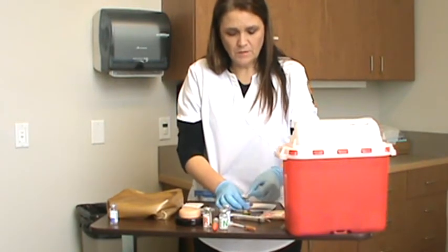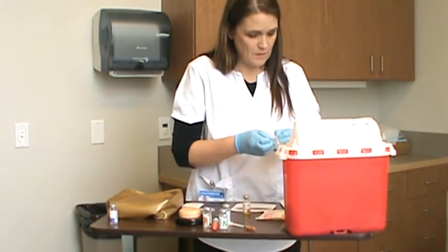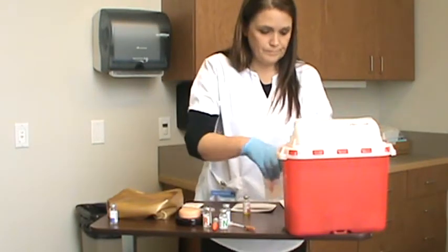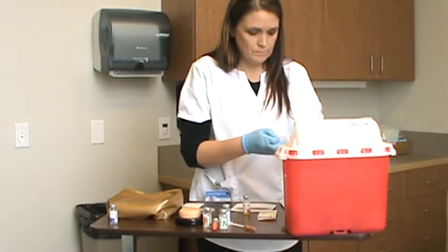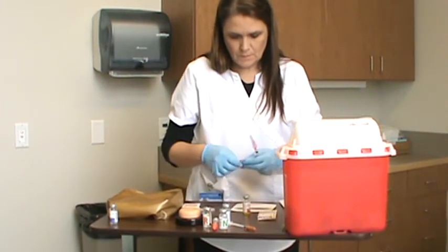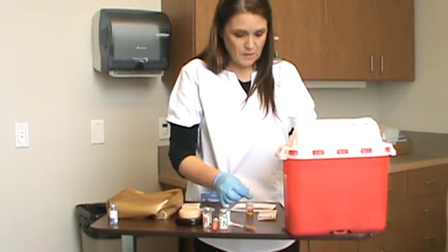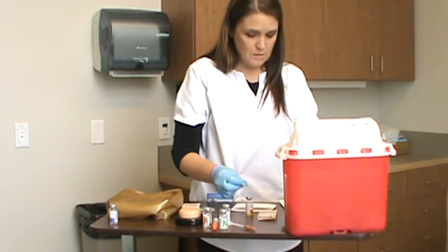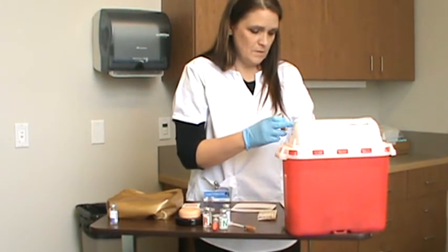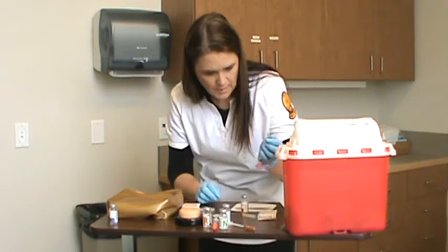This one I could get in the deltoid, but because it's so close to the one, I'm going to give it in her vastus lateralis, in her leg. So my third check was checking with my MAR and checking my bottle again to make sure that it's the right amount, the right expiration date, right dose, 0.9.